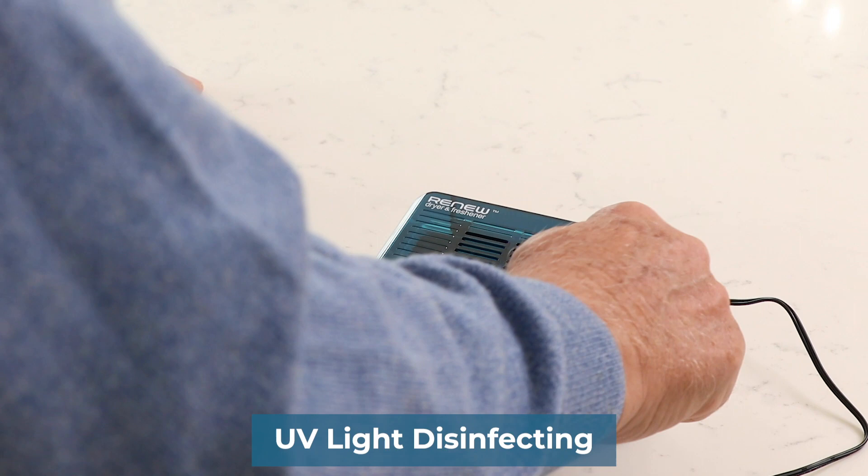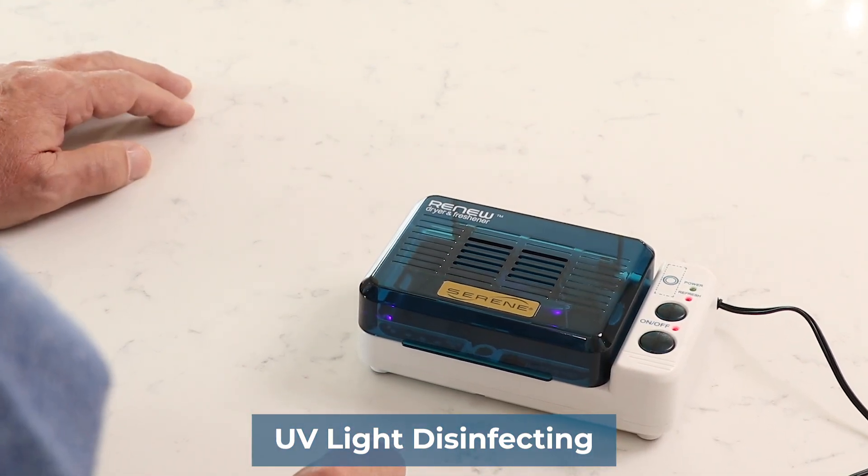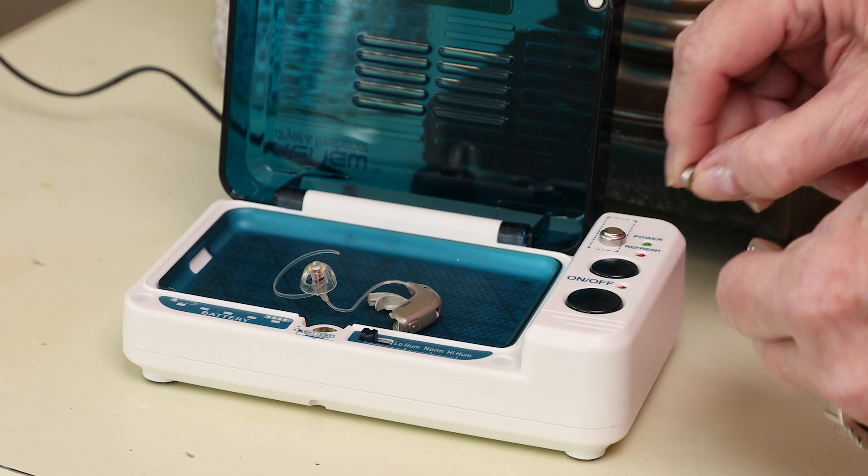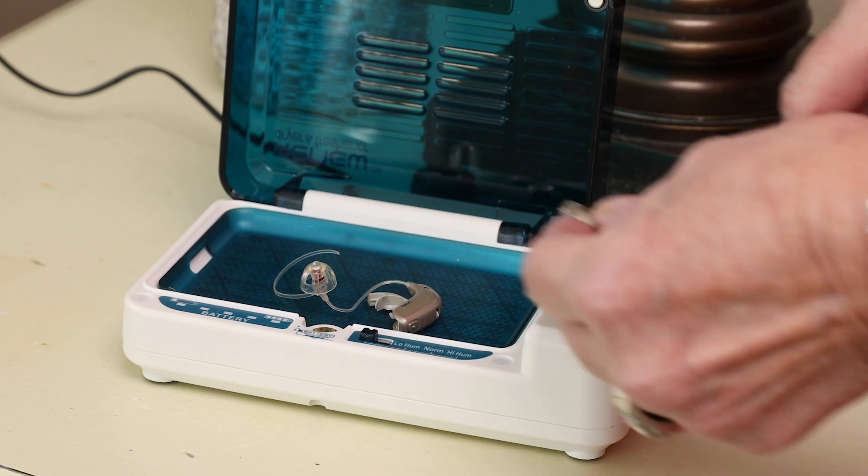Turn on the added UV feature for safe disinfecting. Test your batteries with the built-in battery tester and keep them on the magnetized battery dock while your hearing aids are being cleaned.